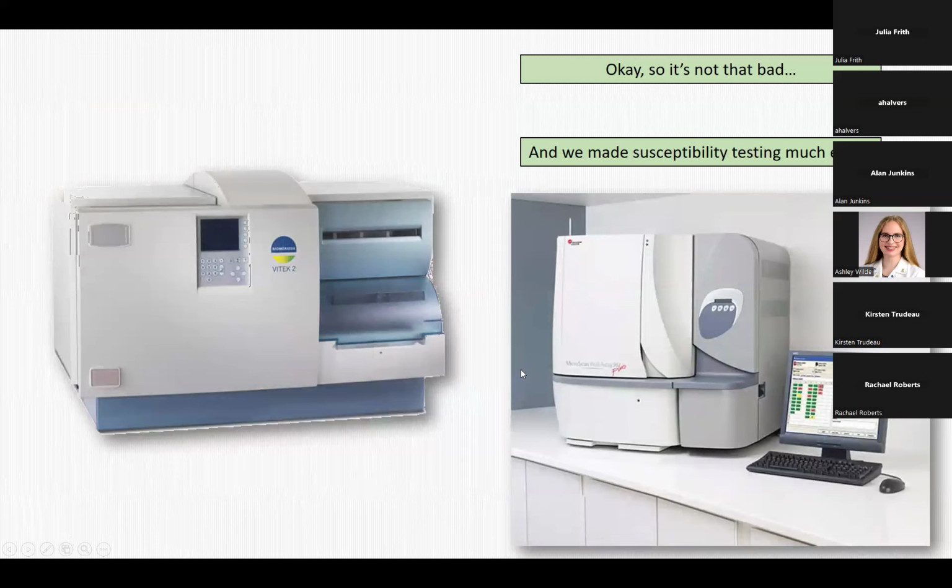We've sort of automated susceptibility testing using instruments like this Vitek or this Microscan. They go on there, it reads the results. It's a small cartridge kind of test. It'll read the results, it'll report the results out. If we were doing this the old-fashioned way, I'd probably have to have 10 or 20 people who did nothing but susceptibility testing all day and twice as much lab space in order to do it. So this has been a godsend to be able to have instruments like this.